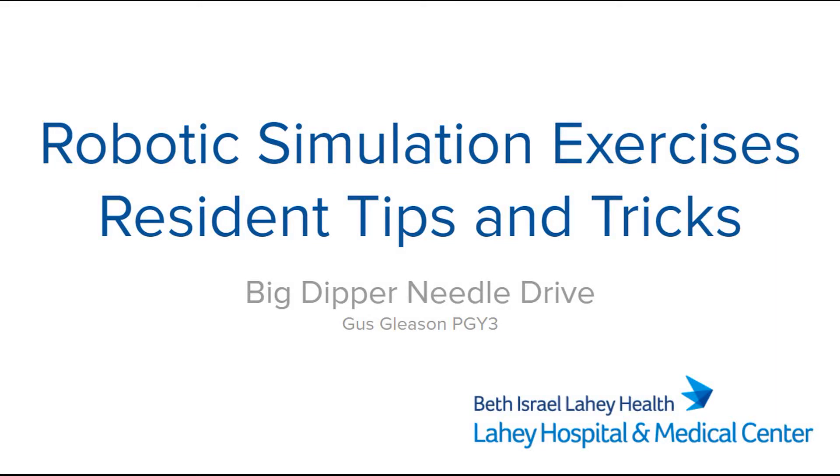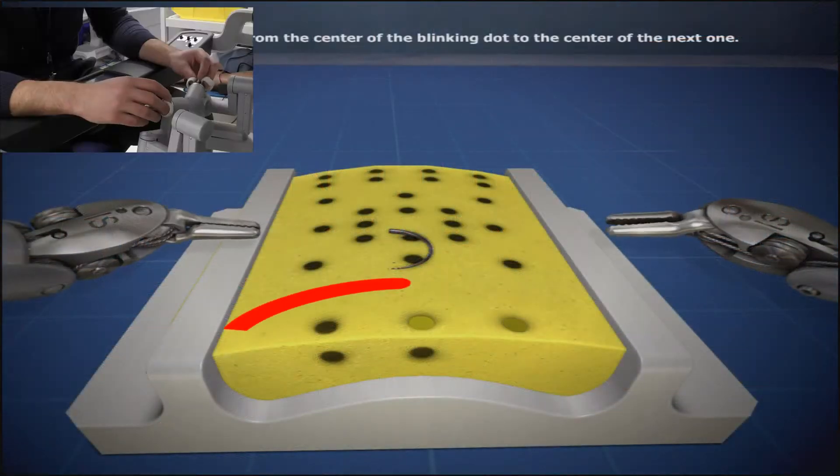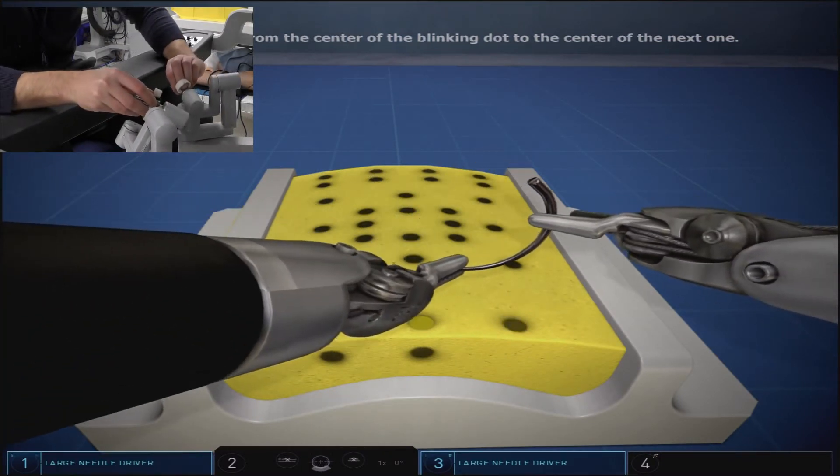Big Dipper Needle Drive is a suturing exercise on the yellow foam simulated suture pad. The exercise is named because you are dealing with only the anterior five dots that mimic the constellation of the Big Dipper.